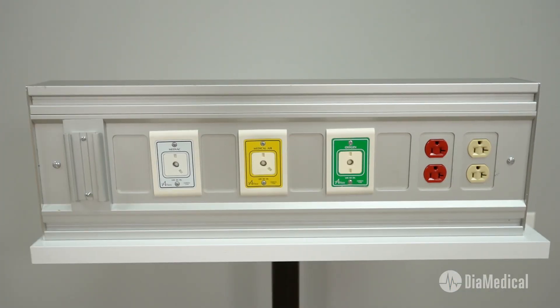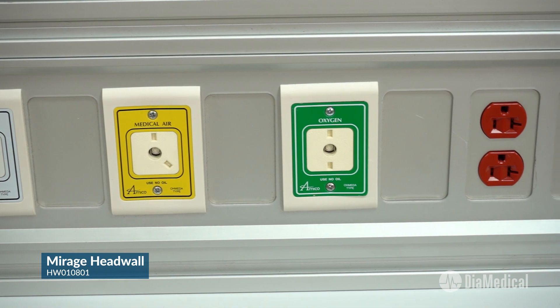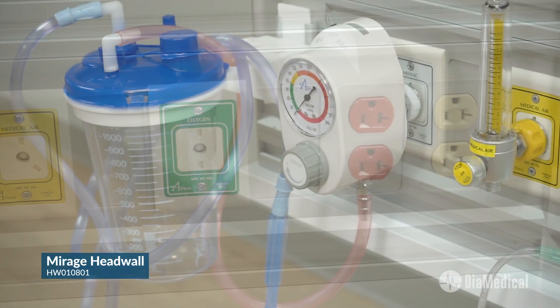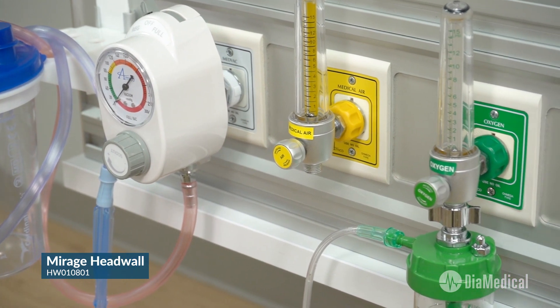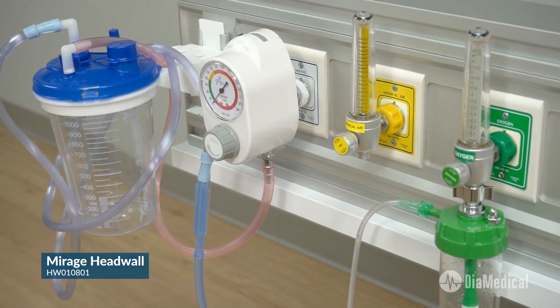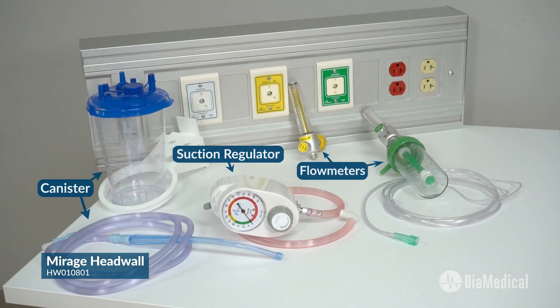The Sim Lab Solutions simulated 30-inch Mirage head wall is great for nursing assistant programs to transform any space into a realistic patient care environment. While non-functioning, this educational piece of equipment is the most cost-effective head wall option. It includes a complete accessories package containing flow meters, a suction regulator, and canister.